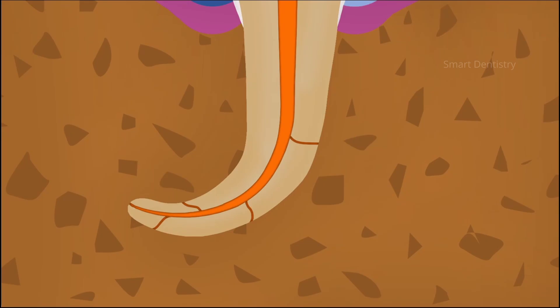But it is extremely difficult to do vertical compaction in canals which are very narrow or have an acute curvature. The plugger used for compacting gutta-percha should reach the apical one-third of the root canal for efficient obturation, but in narrow and curved root canals this is difficult or sometimes impossible.